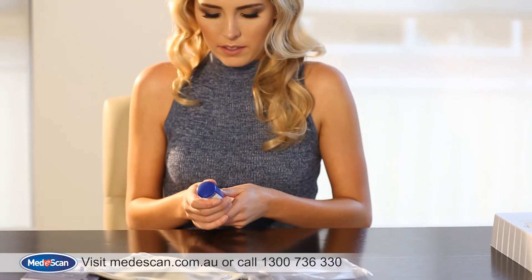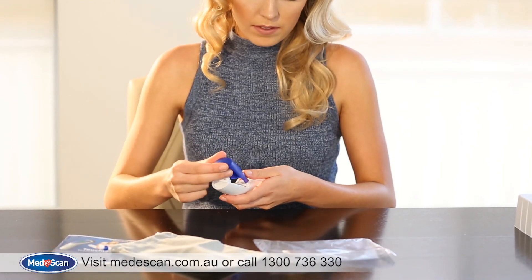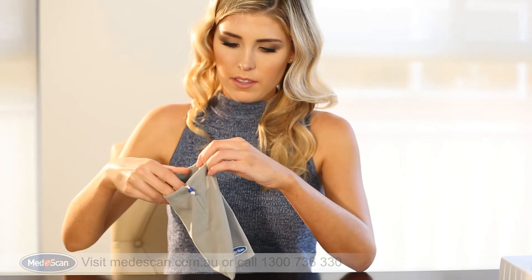It is highly recommended to remove the batteries from your MediScan Touchless Thermometer if you know that you are not going to use it in the near future. We hope you've found this video helpful. For more information, visit www.mediscan.com.au or contact our customer service team on 1300 736 330.